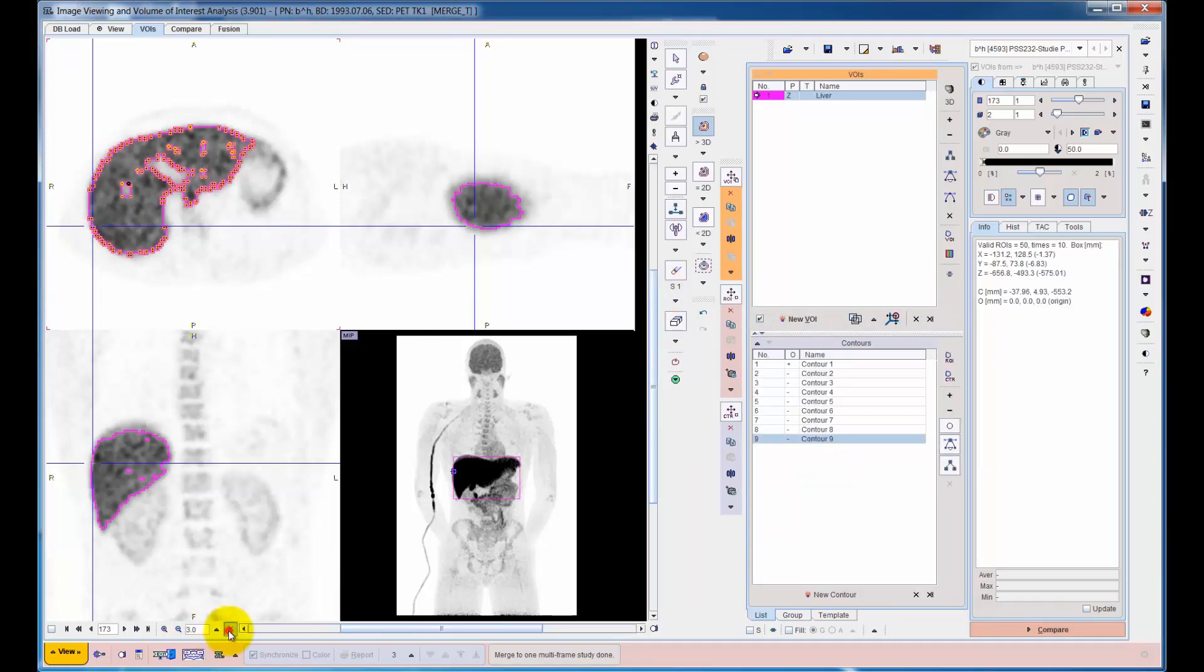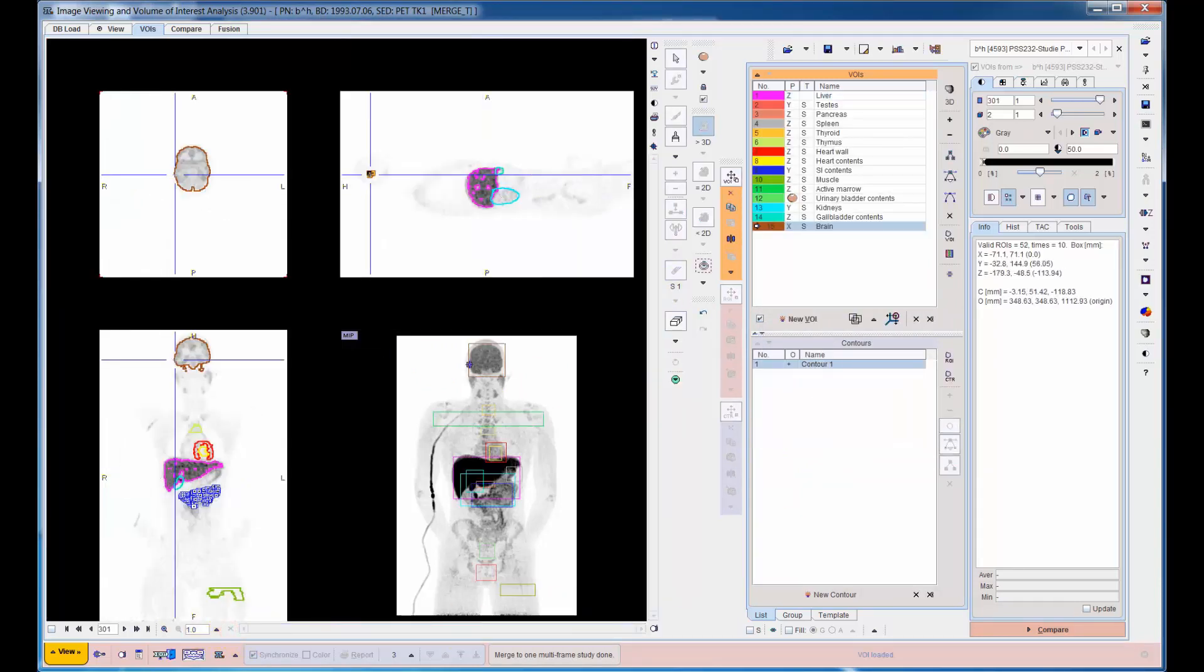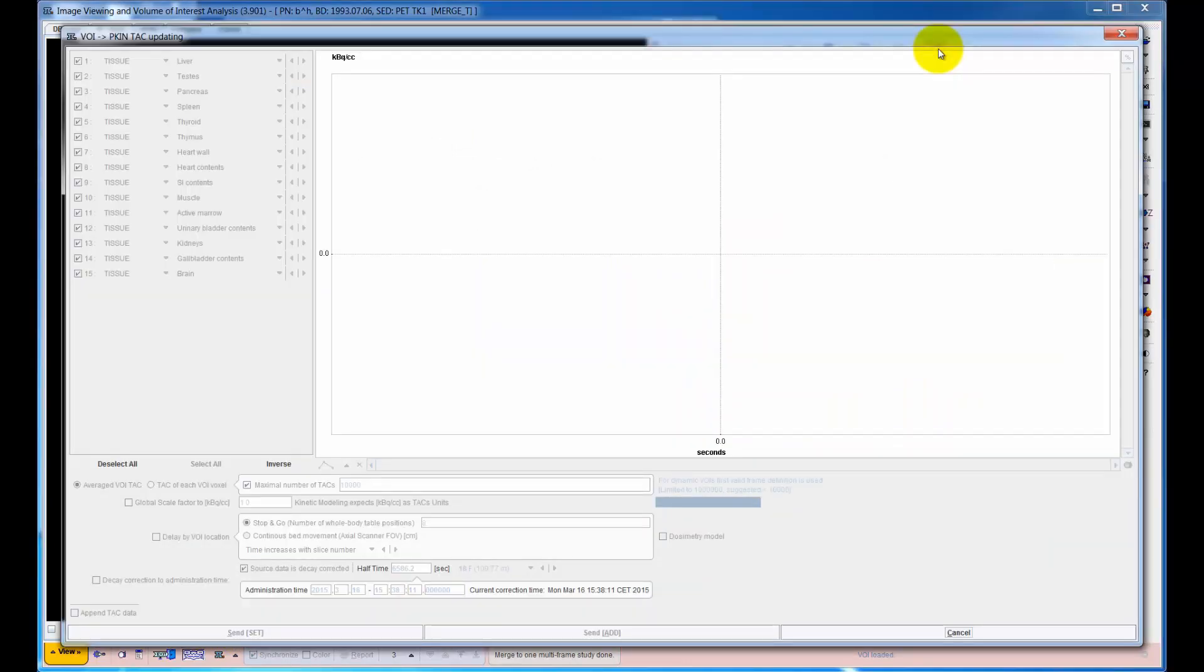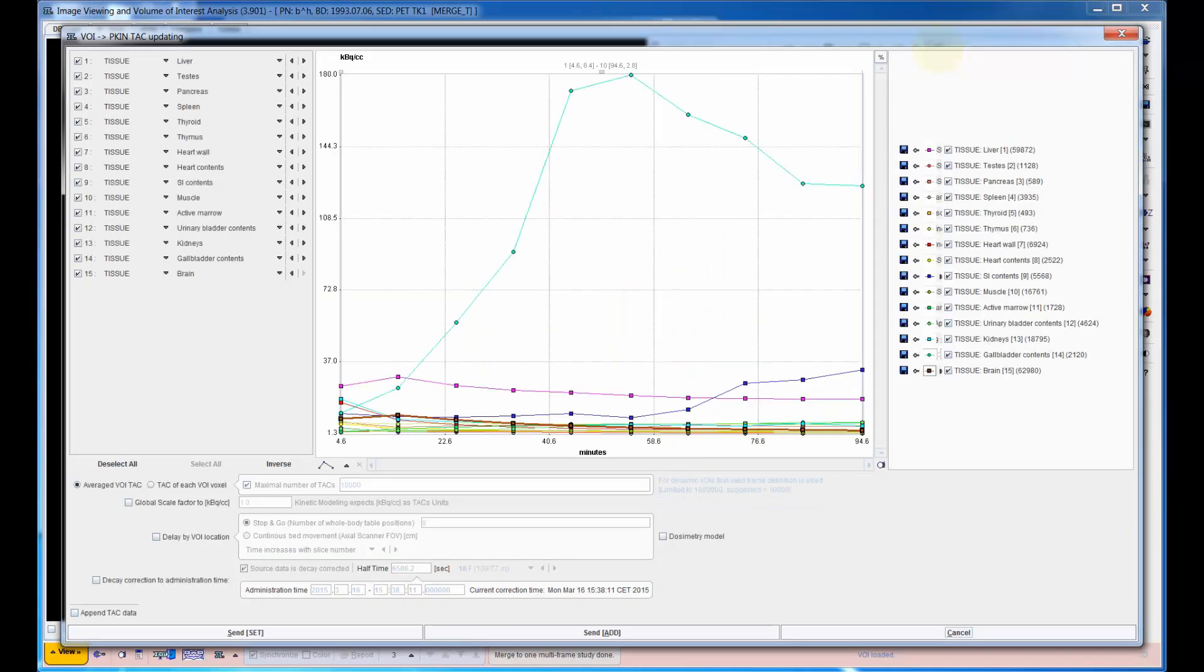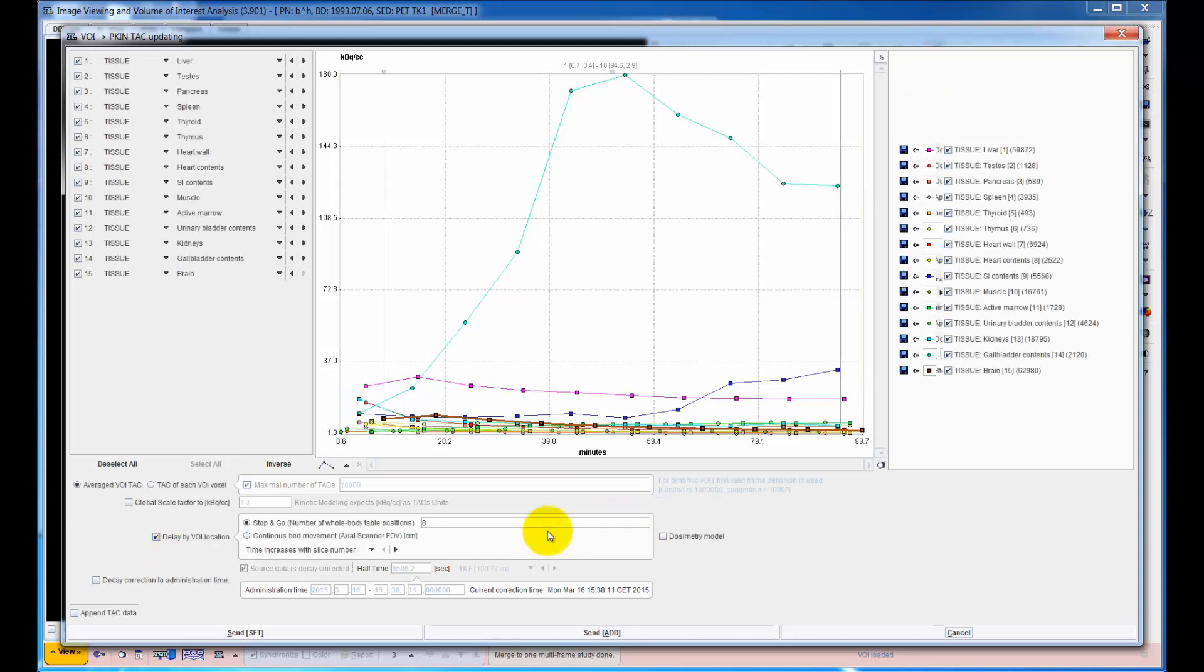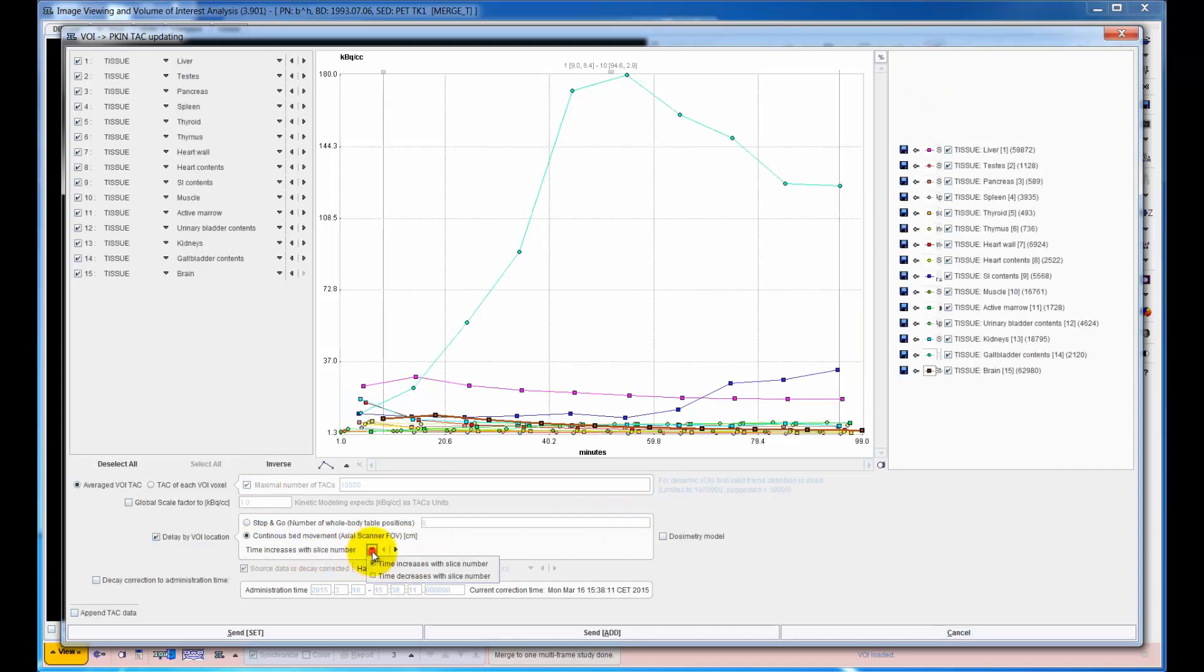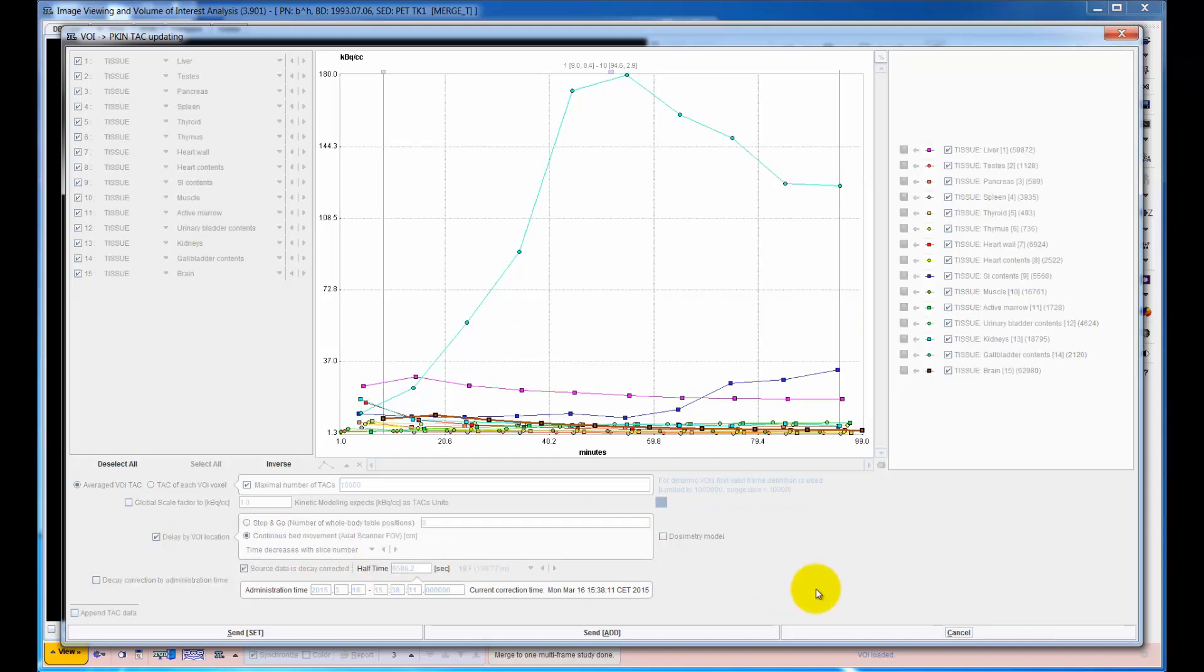After the organs have been defined, their uptake over time is calculated. Note that for this whole body example, the timing for each organ differs slightly depending on their respective bed position. These offsets are calculated by PMOD in order to ensure accurate timing.